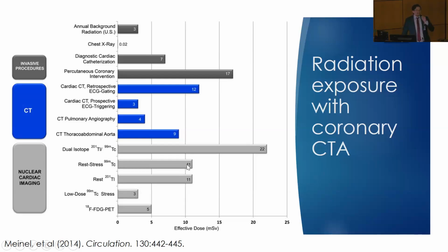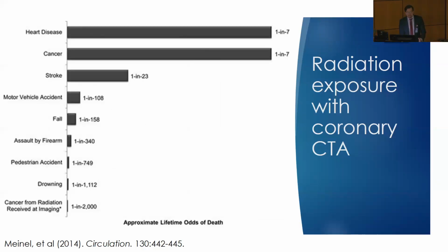It makes me so nervous when I see cardiologists out in the community that do Lexiscan stress tests each year. It's like, oh my gosh, it's way more radiation than they need for a not great diagnostic study. So if you see that being done, maybe call them out like, hey, maybe they need a stress echo instead if you're going to do it each year. So yeah, nuclear imaging has more radiation exposure than you'd expect. So within the spectrum of things, coronary CT is actually pretty safe.